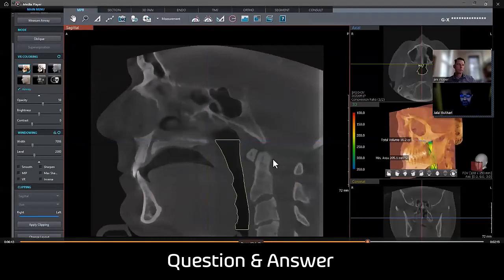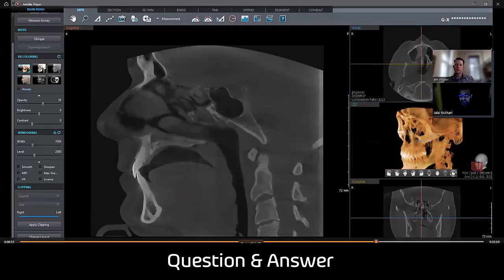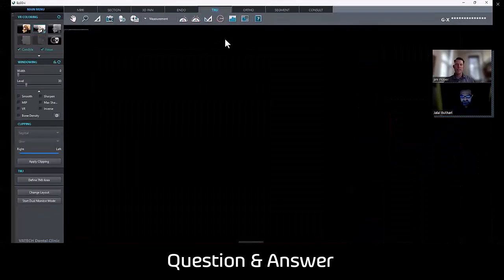But again, great tools, and I believe CBCT software has done a great job in aiding patients who have obstructive breathing disorders. And this also is a good reference to relate to the patients, because they can see, this is me, see these dimensions, and then we can work with them and clinical providers to further treat that OSA, just like you said on there.